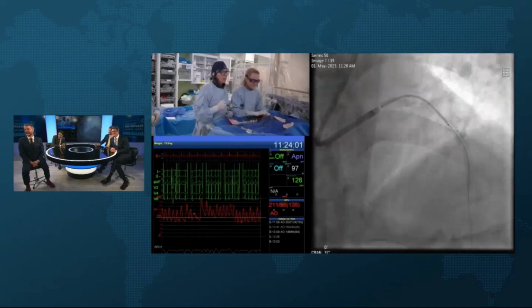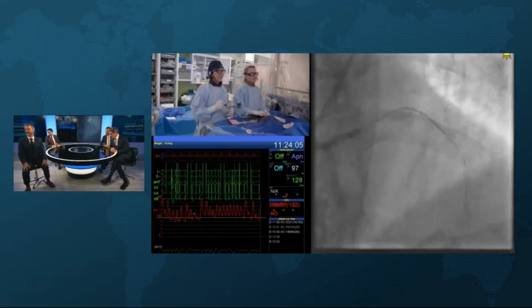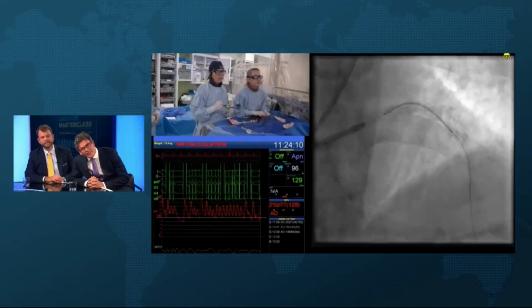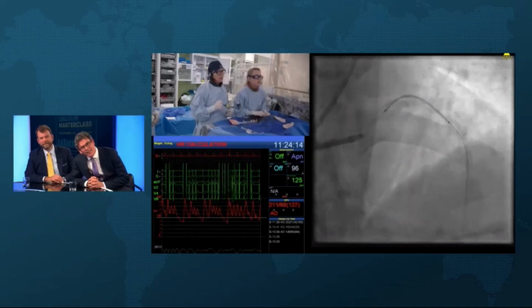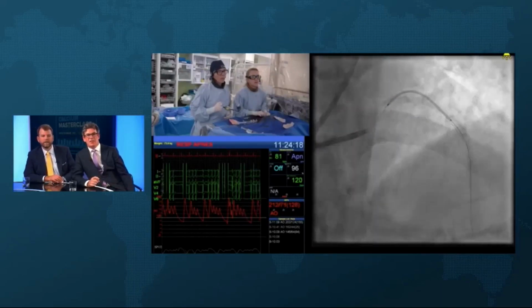Just out again. Okay. Just one touch. Looks like you're short distally. Yeah. Yes. There you go. Maybe it's okay. You might not be able to see the stent boost. That's what I'm doing here. Oh, do you have the boost? Oh, yeah, we can see the boost. Lovely. That's good. That's nice.